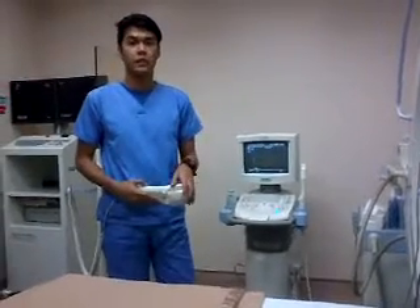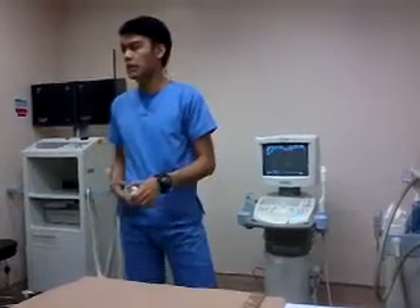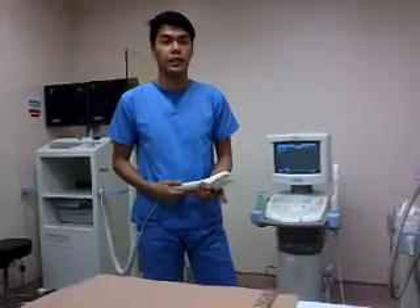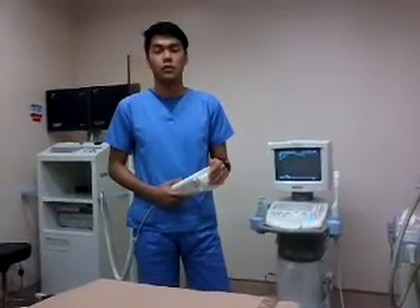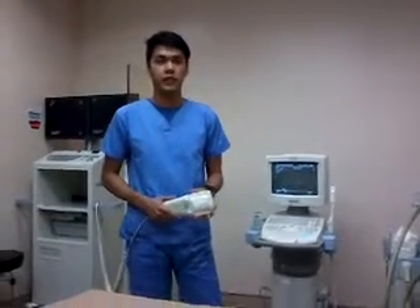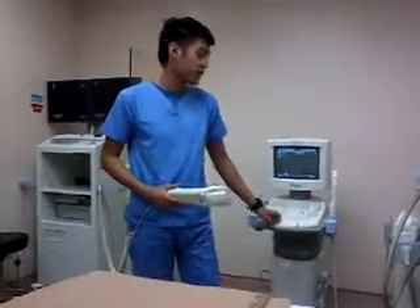We cannot go above that limit because, as ma'am mentioned, our kidneys are highly vascularized. Going above the limit may induce a hematoma, which further complicates the patient — and we don't want that. So we abide by the given standard.